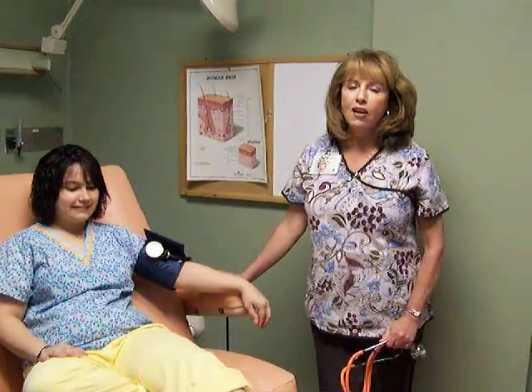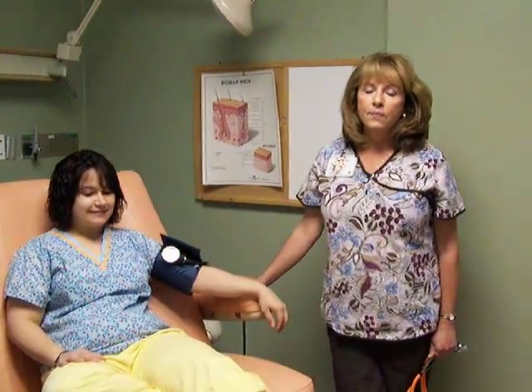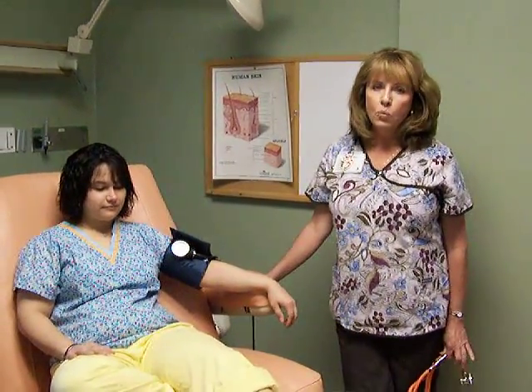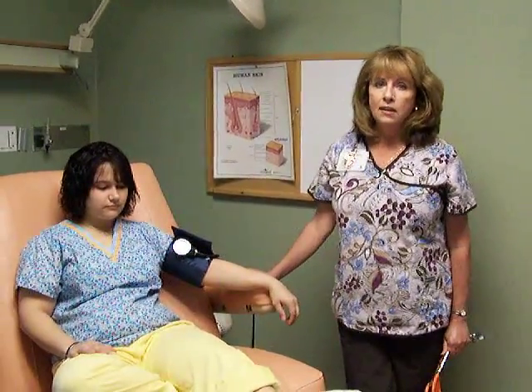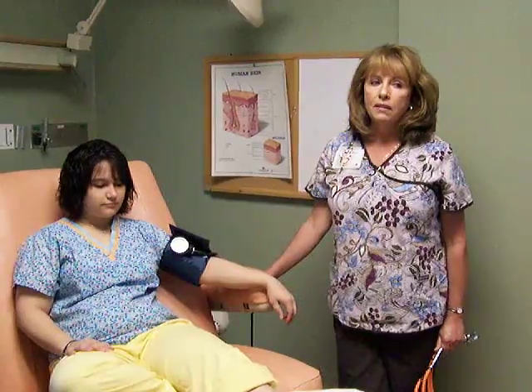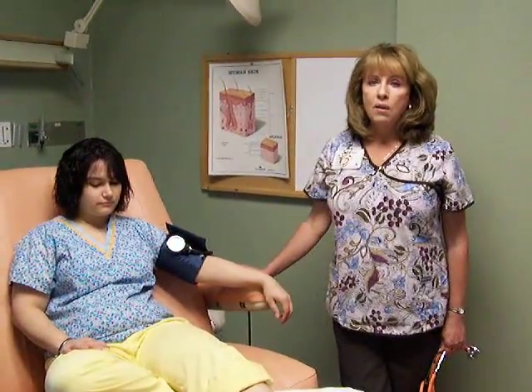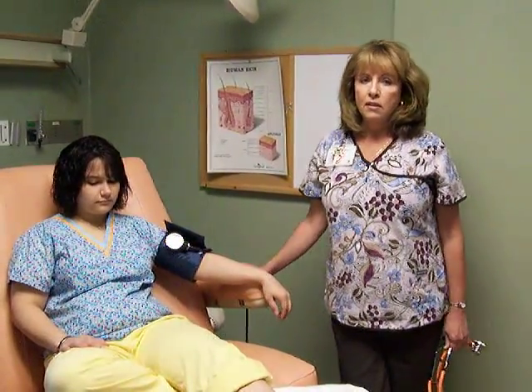Good morning. We're here today to talk about the process of doing an ankle brachial index. You would do an ankle brachial index to establish the quality of arterial flow, especially in patients who have lower extremity wounds and who you are thinking about using compression on as a treatment. The setting today is an outpatient wound clinic, so part of our normal new patient workup for patients with lower extremity wounds is to do an ankle brachial index, and today we're going to demonstrate the process of obtaining that.